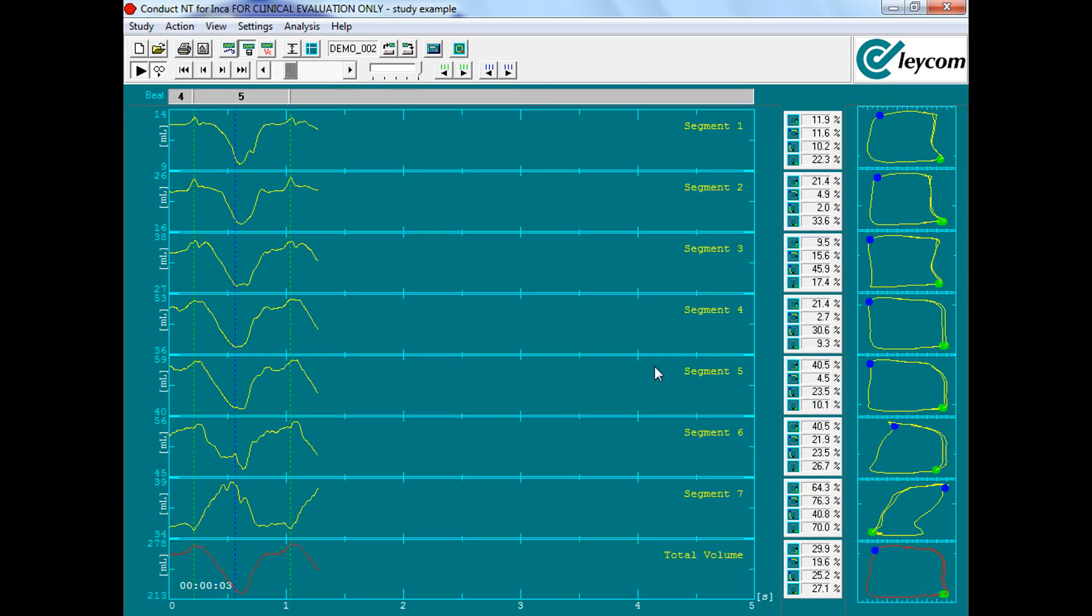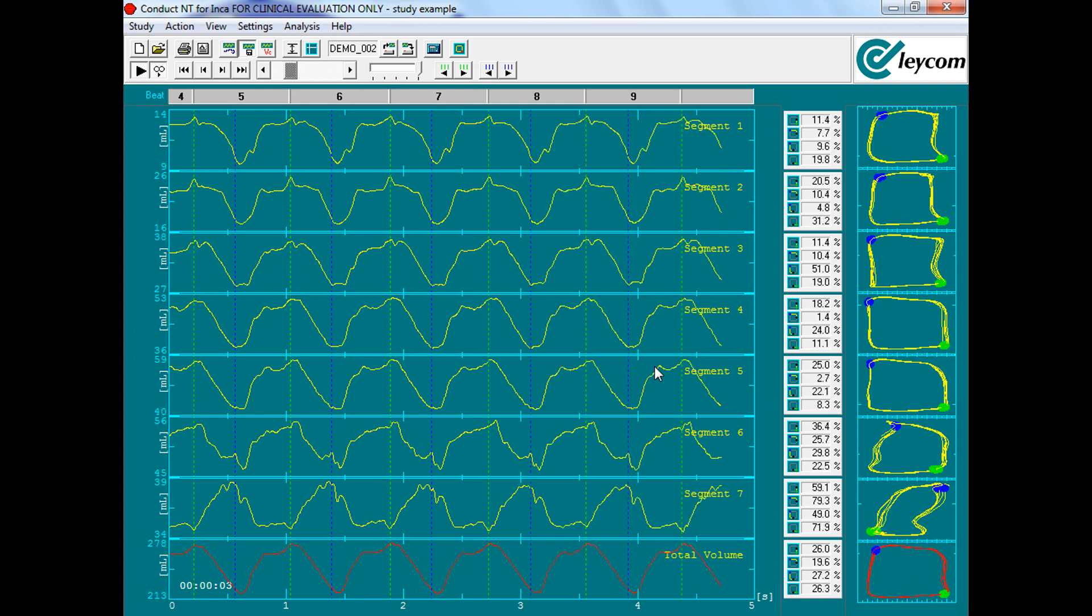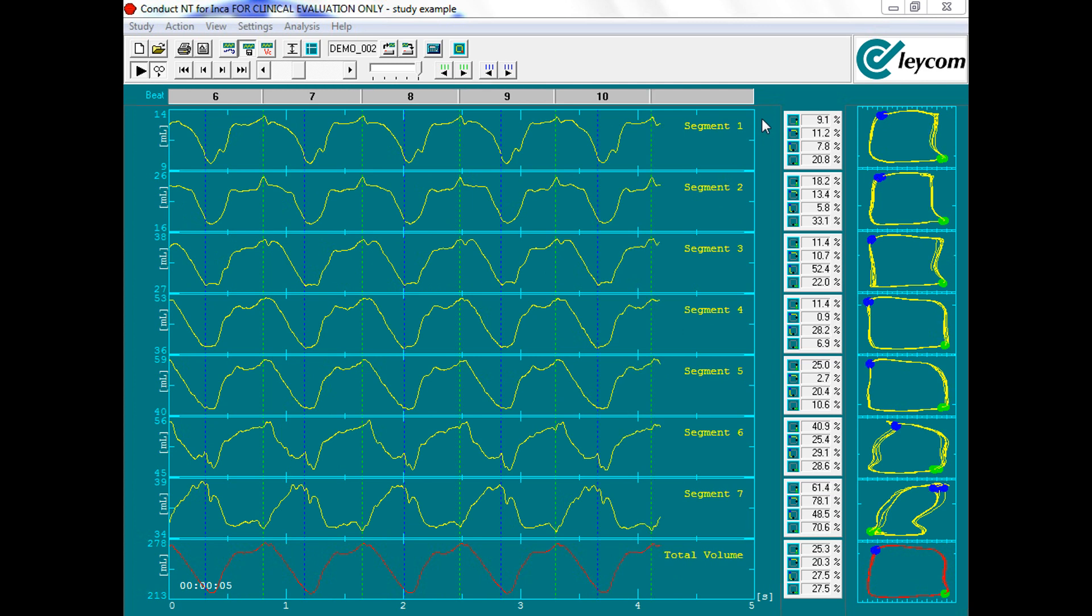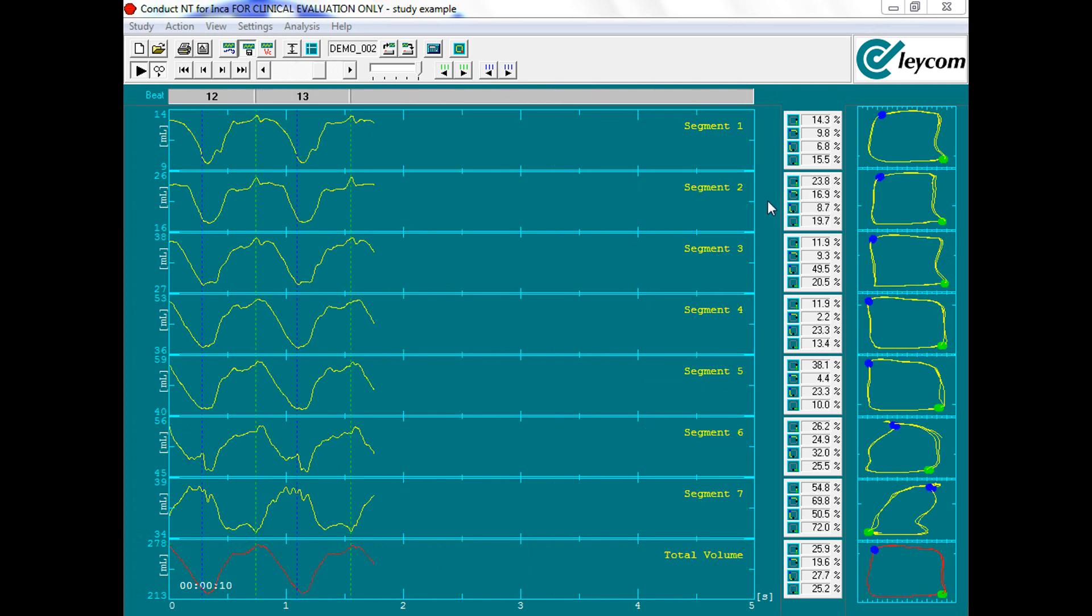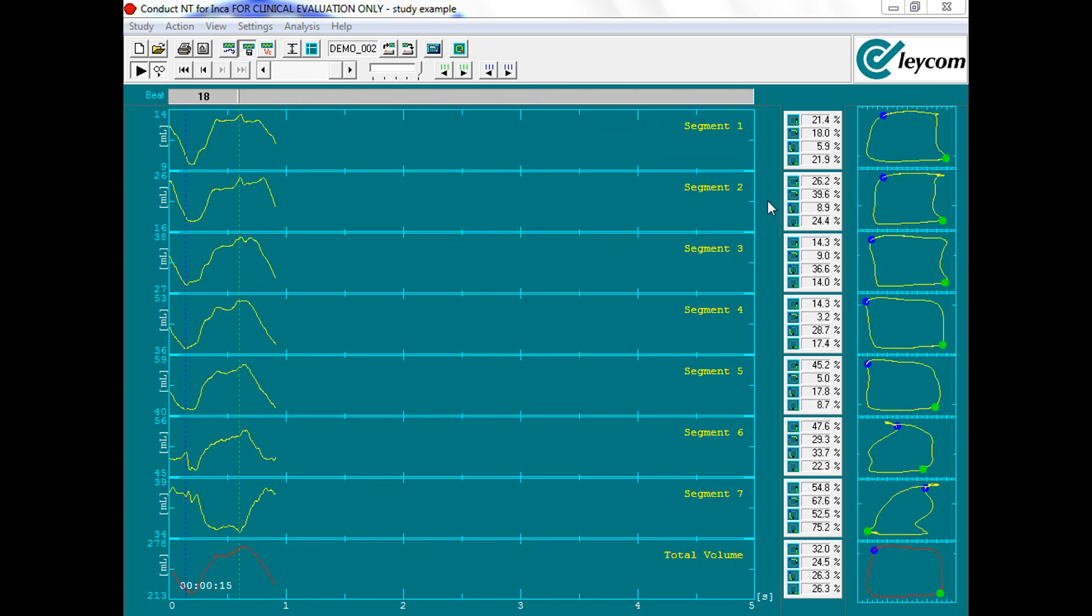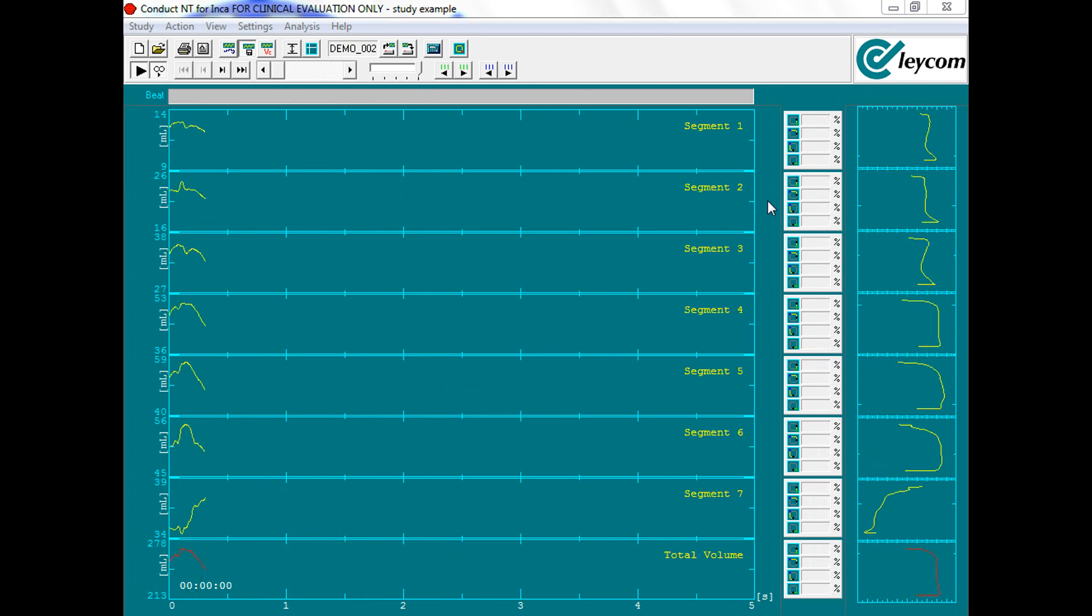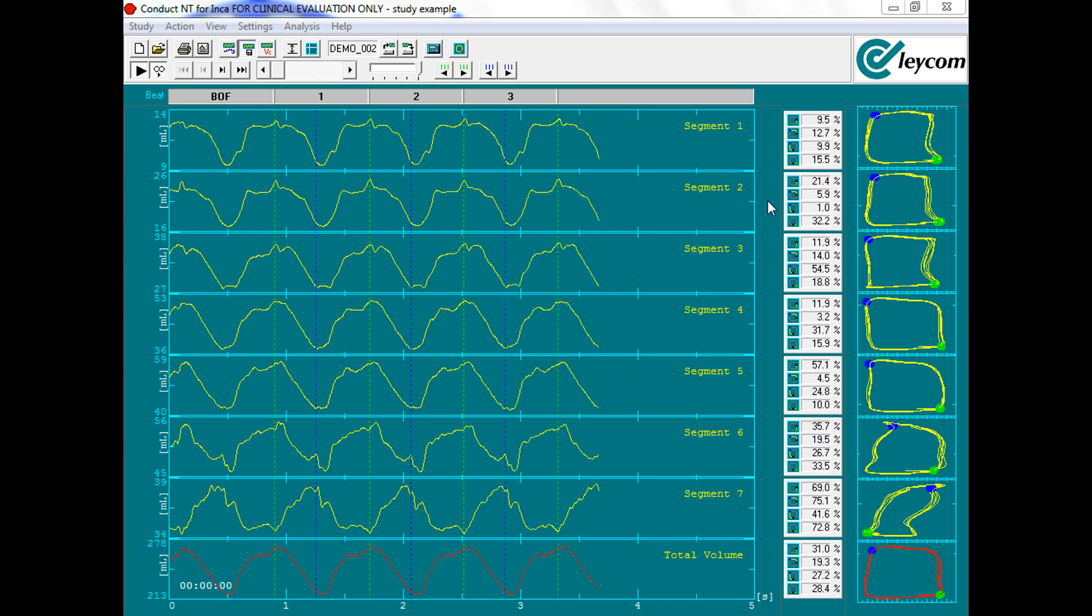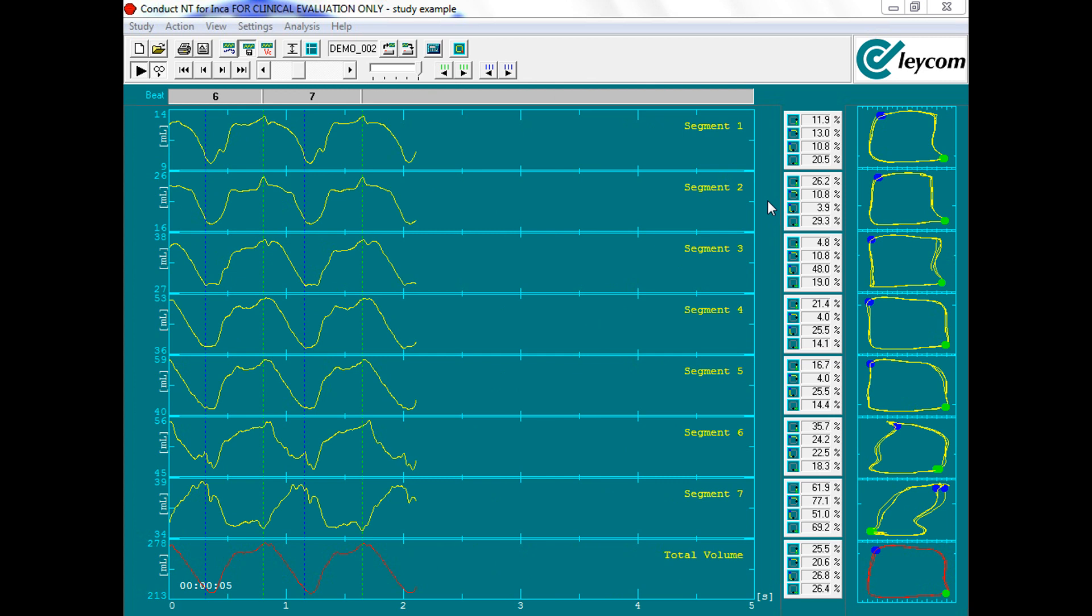If the segmental loops towards the distal end of the catheter, specifically segments 1 through 3, are not moving in a counterclockwise motion or have a rectangular shape, then it's recommended that the operator reposition the PV catheter by either: a) pulling back on the PV loop catheter and re-delivering to the apex, or b) providing a quarter of a turn and using the pigtail to center the catheter shaft.